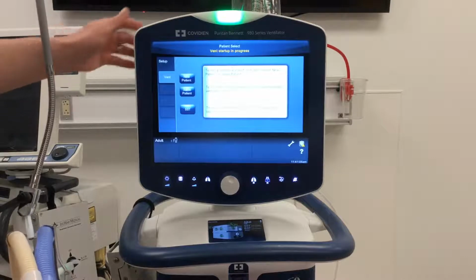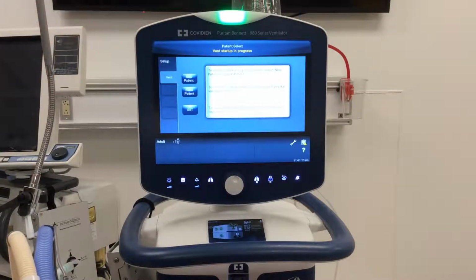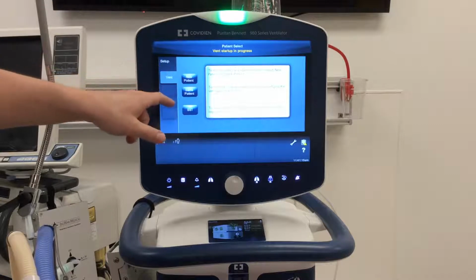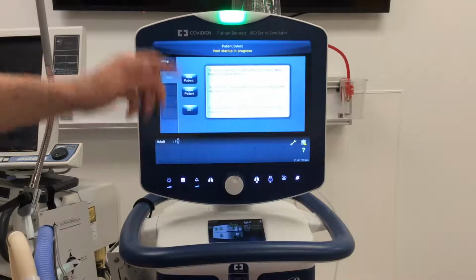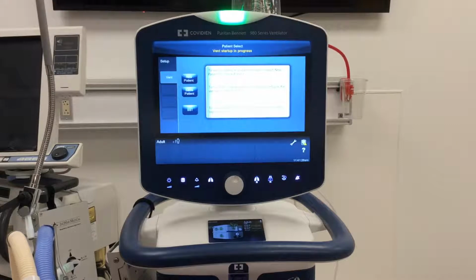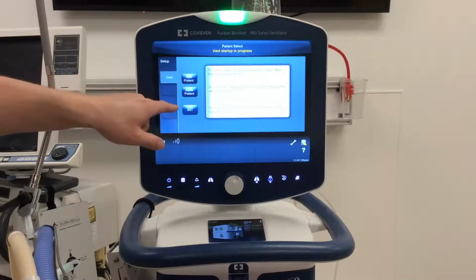Whenever you do turn it on successfully, it's going to come to this first screen, okay? So from here, we can access a lot of different things. You can see we have the ability to choose a new patient, which is what we're going to focus on here today. Say you had a patient that was on this ventilator in the ICU and they went down to the operating room and you're trying to resume previous settings, you can hit same patient and it's going to pull up the last stuff you had inputted. We'll focus on this once again when we get back into class.